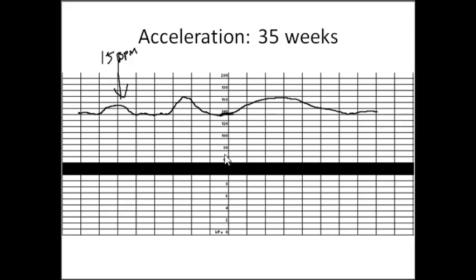Remember, this is fetal heart rate, and then each one of these is a minute. So this acceleration began at minute 0, or at time 0, and by time 2 minutes, we were back at baseline. So that met that requirement. It went up at least 15 beats per minute. So that would meet the requirements for both before 32 weeks and after 32 weeks in reality. And so that would be an acceleration. We returned back to midline. And it lasted for more than 10 seconds.